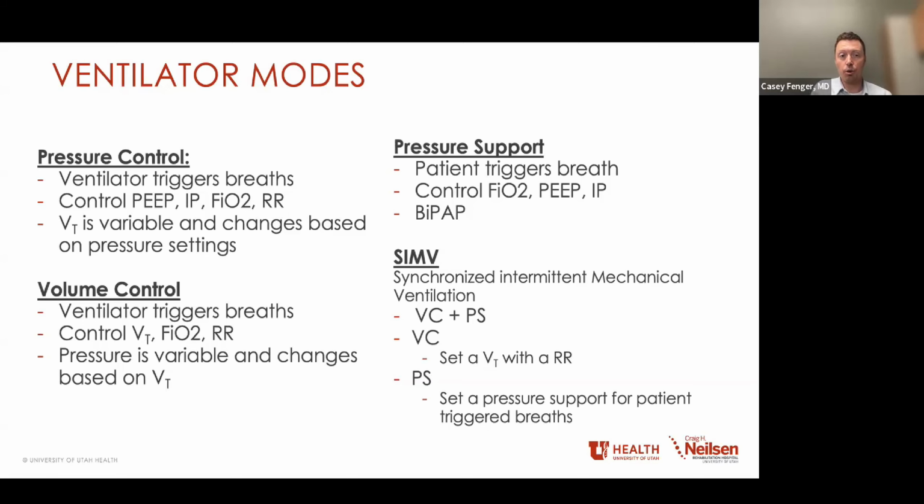So pressure control, you control the PEEP, the inspiratory pressure, the FiO2, and the respiratory rate. What you don't control is the tidal volume, and this is variable and changes based off of the pressures that you set. Volume control is kind of the opposite. You control the tidal volume, the FiO2, and the respiratory rate, and the pressure is variable based off of the changes you make in the tidal volume.